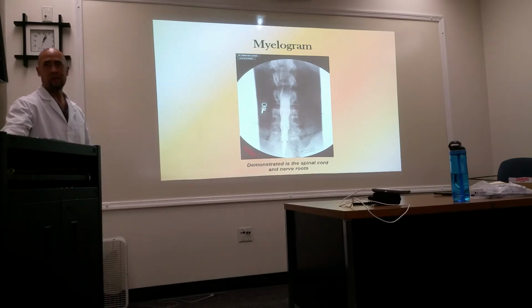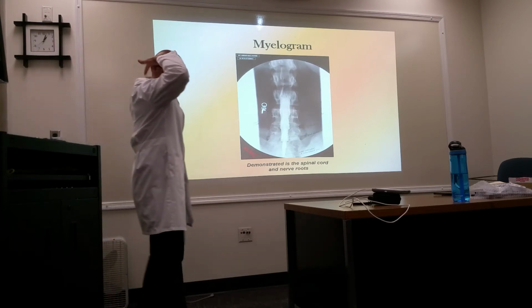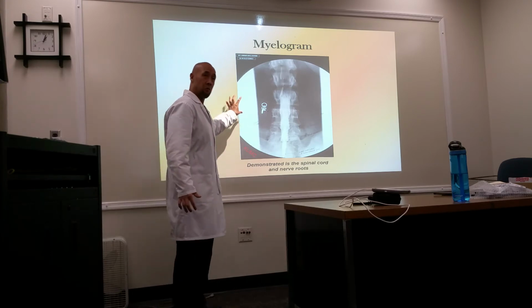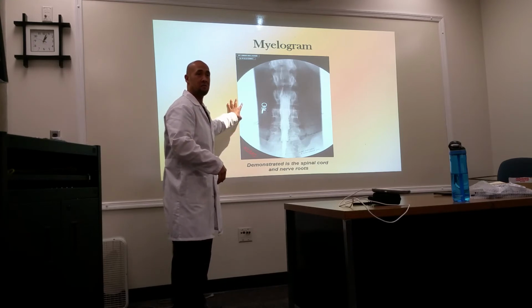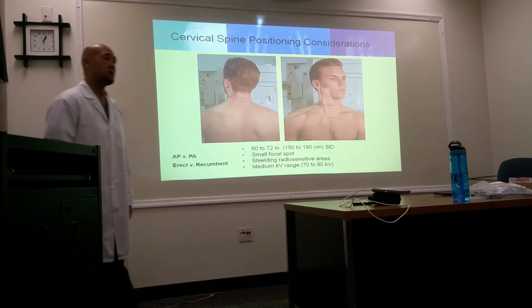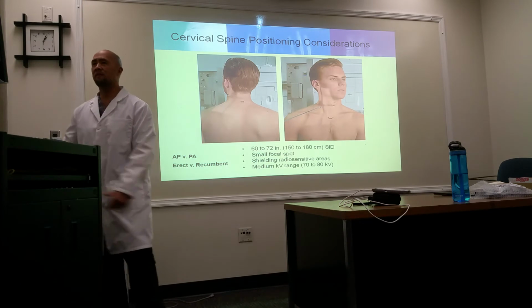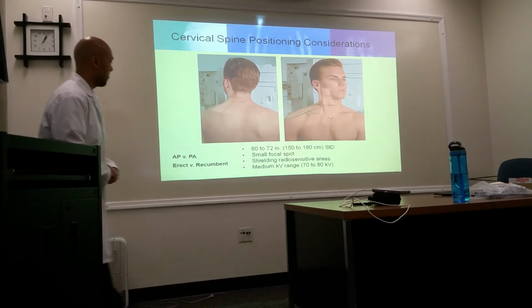Myelogram. Okay? So what they'll do is they'll inject contrast in either your neck, your back, or your lower back, take some radiographs, and then they'll send them to CT to do a more precise study with a contrast. Okay. All right, questions? Okay, so let's just fly through the positions for cervical spine.